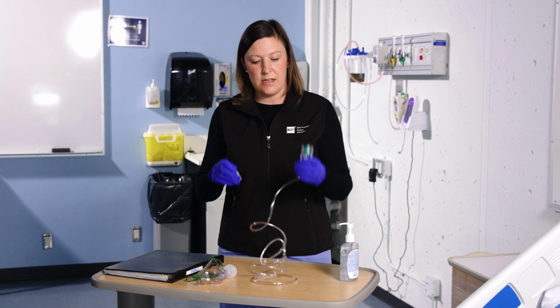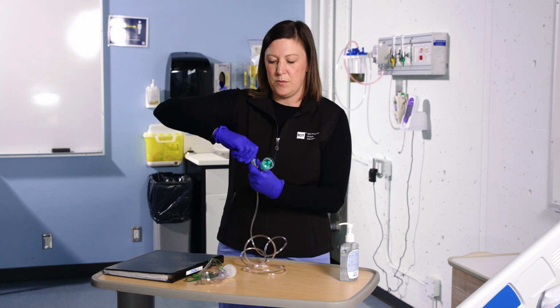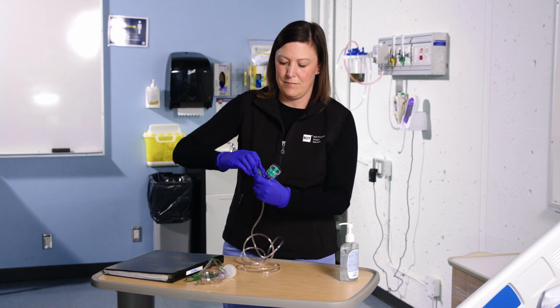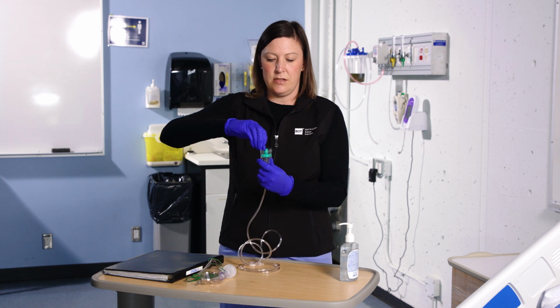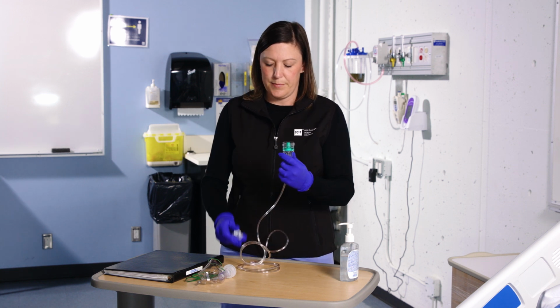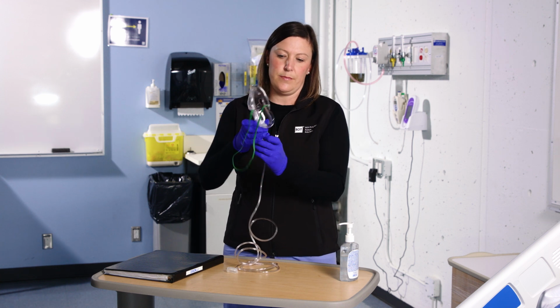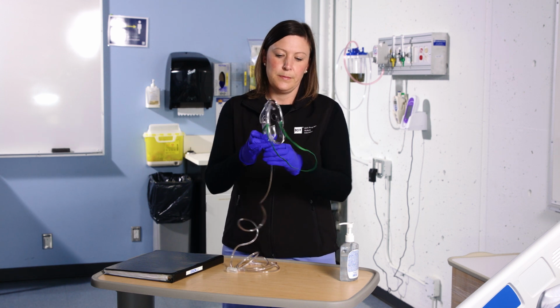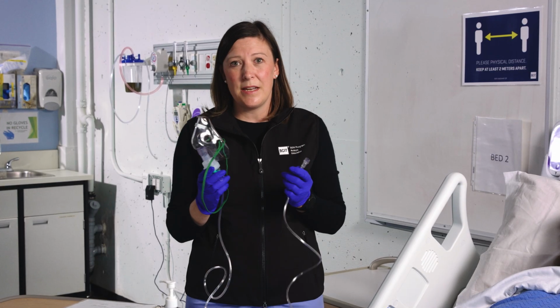I'm going to take the nebulizer tubing as well as the cup here. I'm going to twist off the top. And I'm going to pour the medication into the nebulizer cup. I'm going to screw on the cap. And that's it. Okay, so now I'm ready to administer the medication to Mrs. Jones.